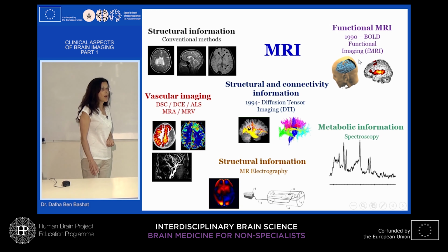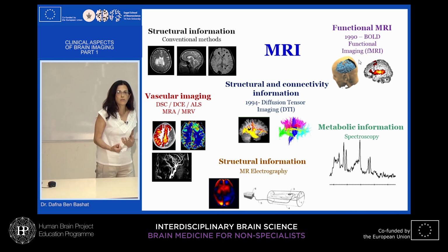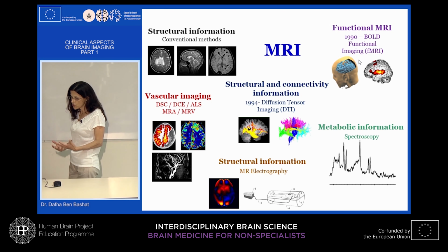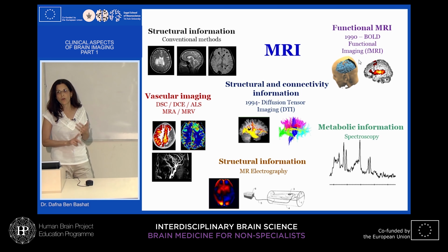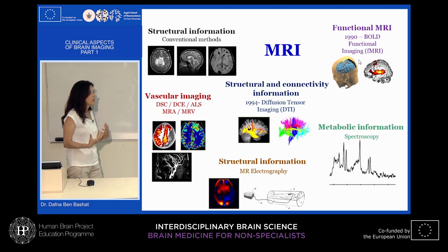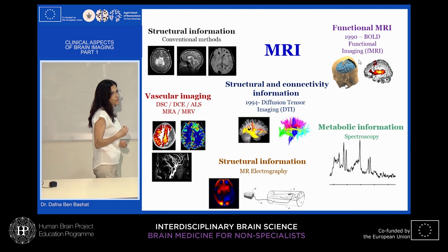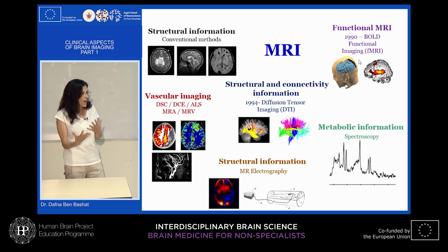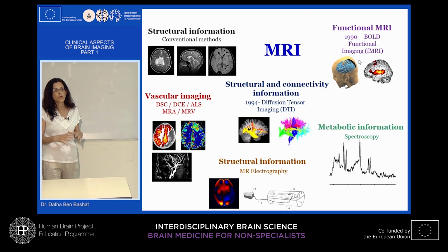So functional MRI is a method with which we can really map and get information about brain areas that are functioning. We can do this also with PET, and there are other methods, but this is indirect, non-ionizing radiation, and we can really map it. And the shift now is from talking about areas of activation responsible for specific tasks to nerves that are working together towards a network.